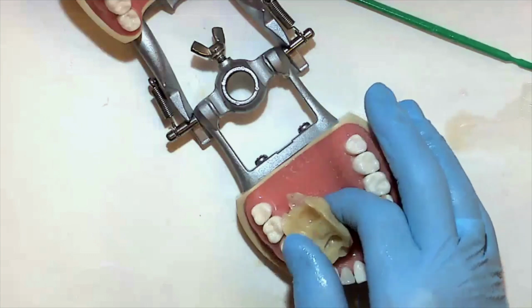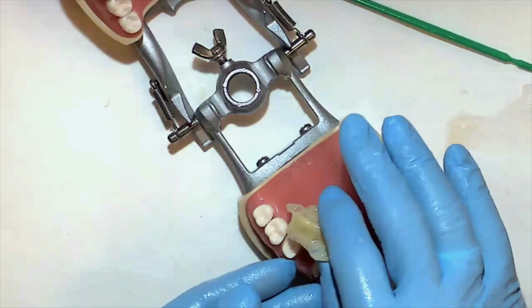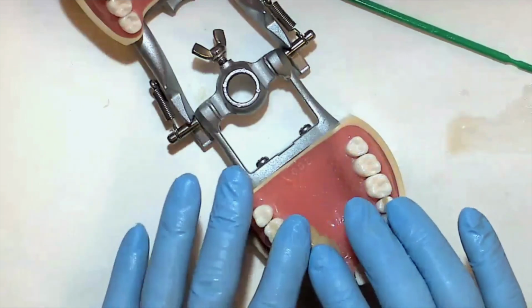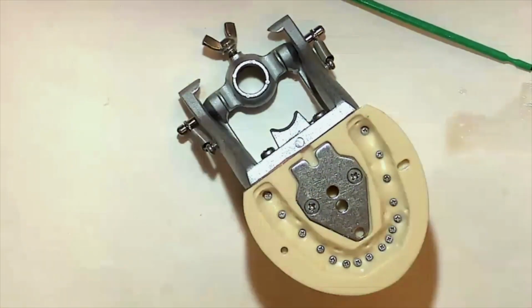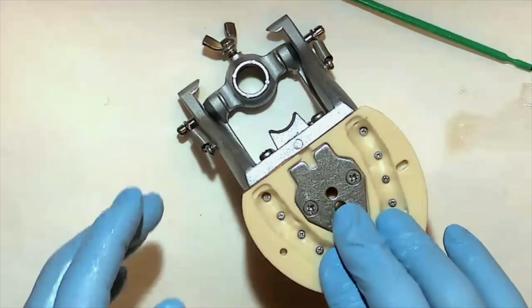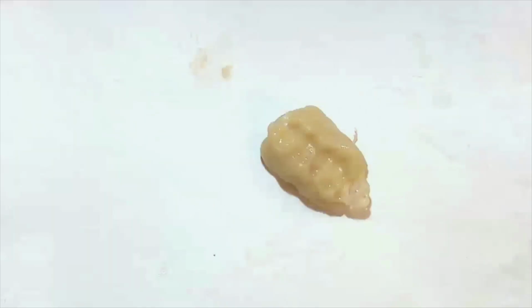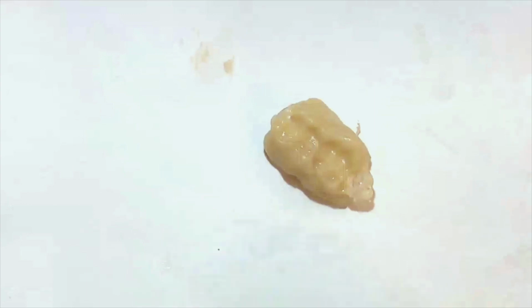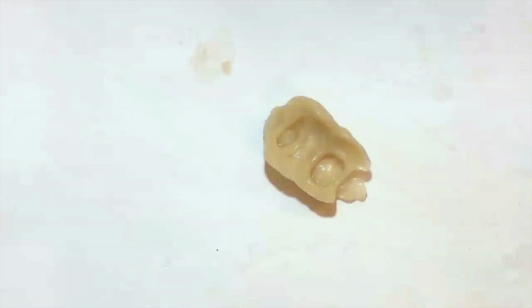Now it's getting a little harder, still a little bit rubbery. Close it down again to maintain our occlusal height. And here is our finished block of acrylic. This is the intaglio surface.